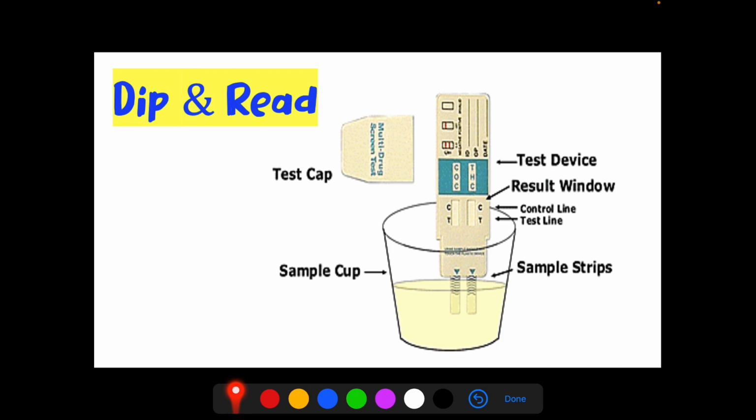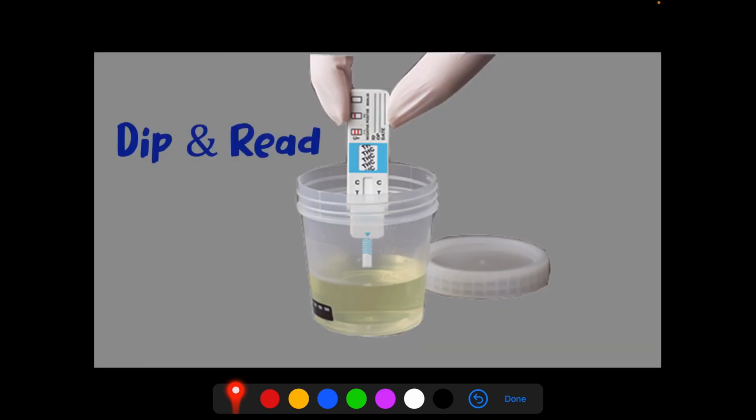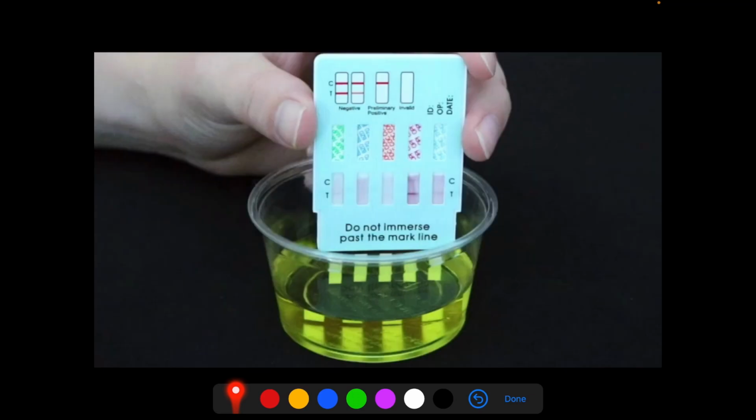Next one, we have dip and read. As opposed to pipette and read, you don't need a pipette. You just have to dip the kit in the specimen, and after a matter of minutes, you also have to read the result of the drug test. So just like this one. Also this one, dip and read method. This is for multiple tests. You can see here that no matter how faint the line is, it's considered negative, and also invalid if it doesn't have a control.